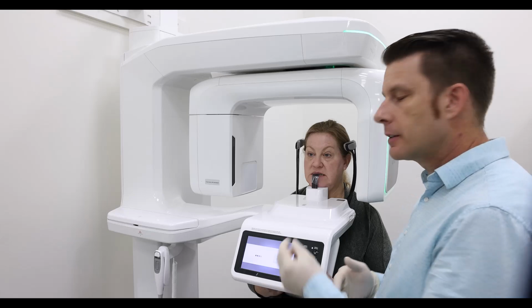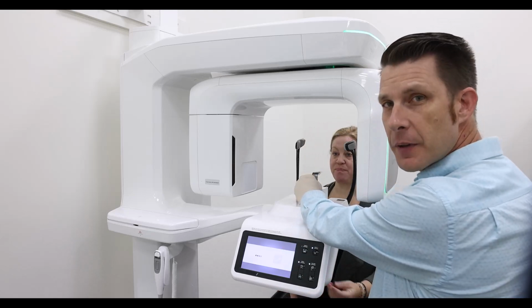I'm going to go ahead and have our patient take a step back, and we can release them from the device.